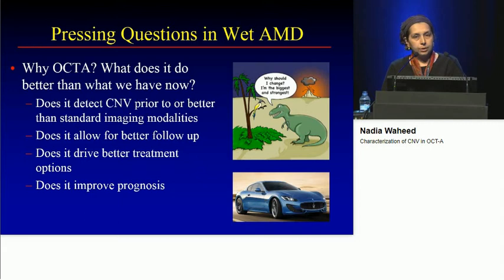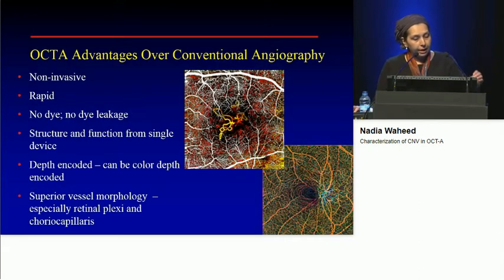And are there ways in which OCT angiography may help us improve our patients' prognosis, either by treating smarter or by developing medications that help us treat these patients better?